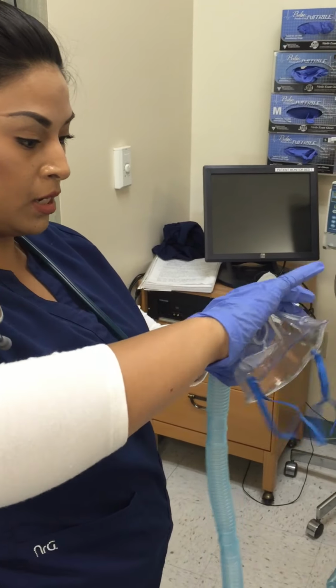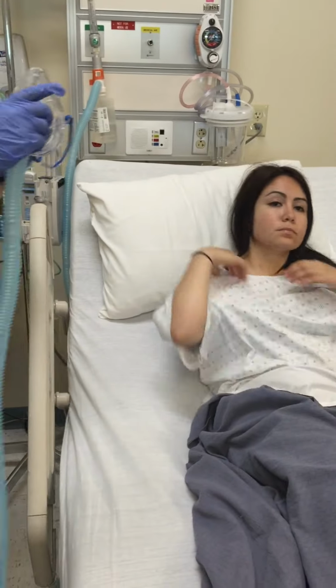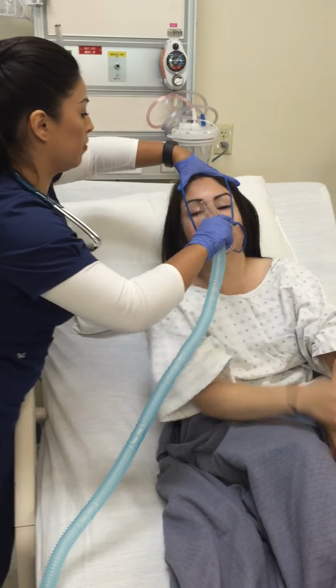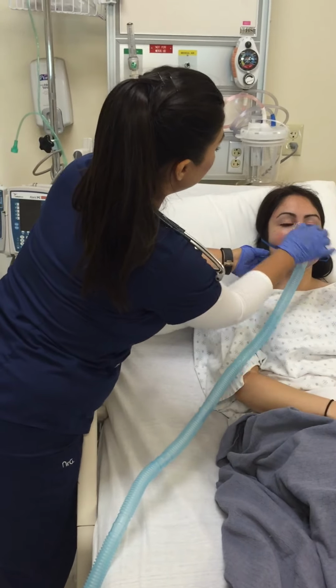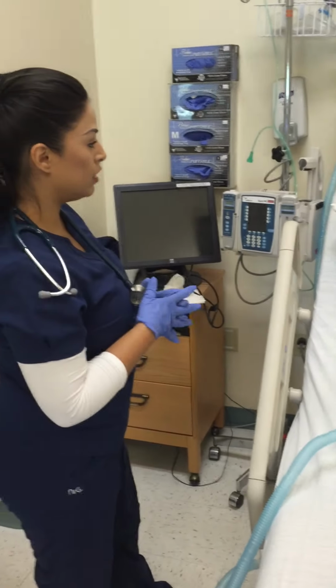Okay. Now I'm going to attach this to the patient. I'm going to ask that you lift up your head a little bit, and I'm going to help put this over your face. It should be a little over your ears. How does that feel? Feels good? Are you comfortable? Okay, great. Do you feel some of the humidity coming out of it?